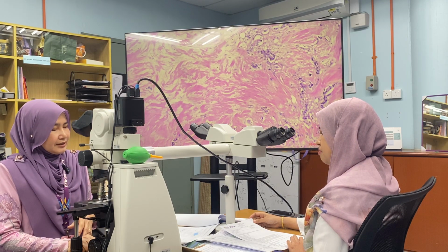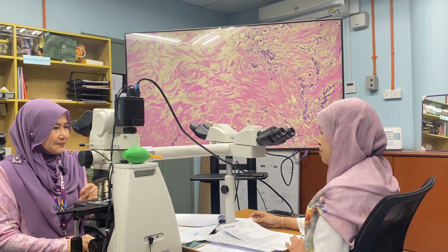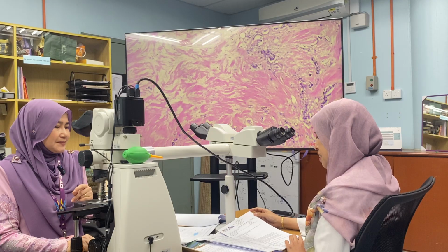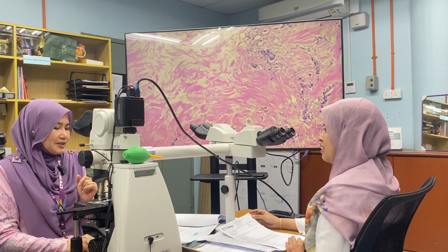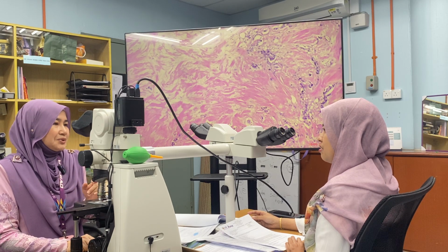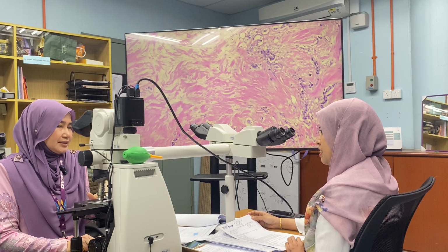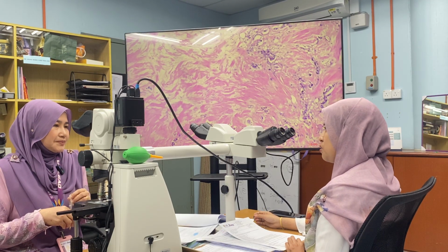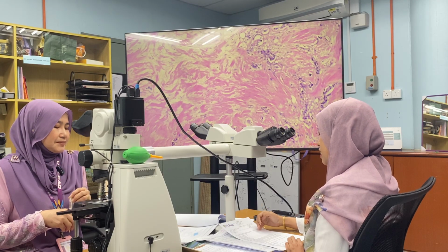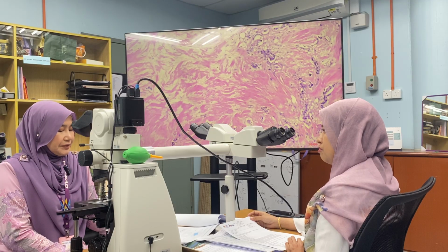What about DCIS? Do you see any DCIS in your case? In the specimen that I have examined, there is no DCIS that I noted. If you have DCIS, what should you do? We need to grade and also report regarding the DCIS. What do you mean by grade DCIS? Is it low grade or high grade DCIS, and also the size and the distance of DCIS to the margin. All right. Okay. And then, do we need to assess the changes in DCIS post chemo changes?